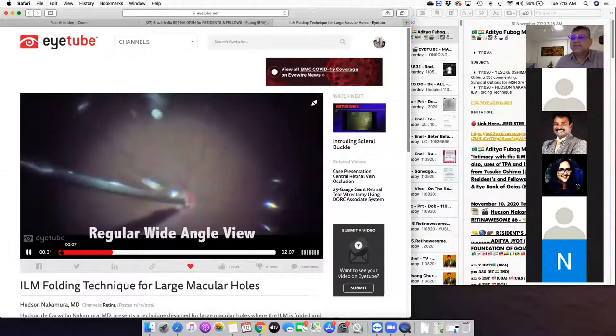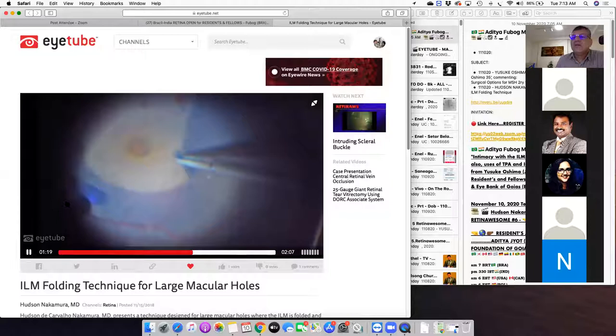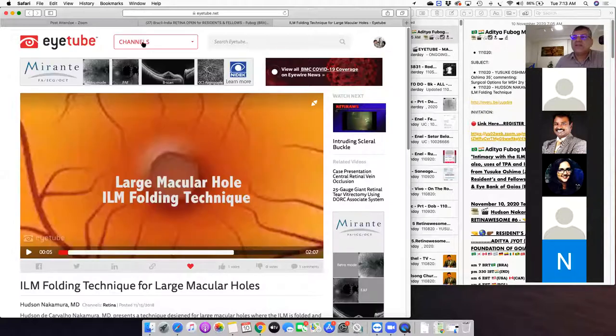I will share with you my screen. I got this video from iTube that I published some time ago — last year it was published on ILM folding technique for macular holes. Let me share the screen first. Can you see the screen? Large macular hole ILM folding technique.